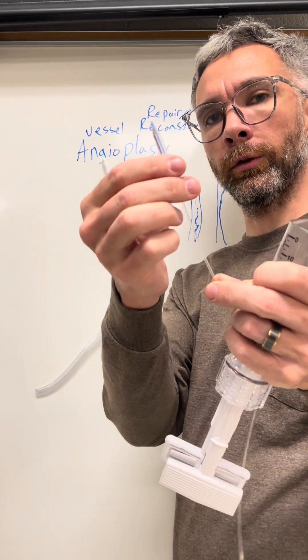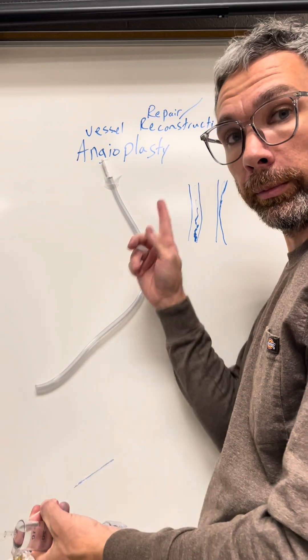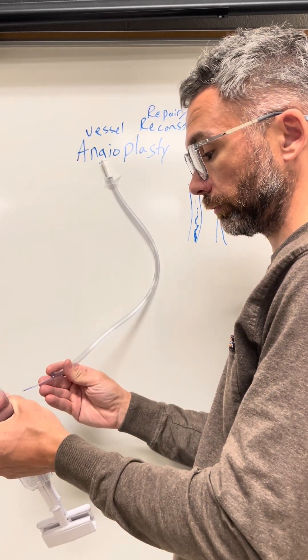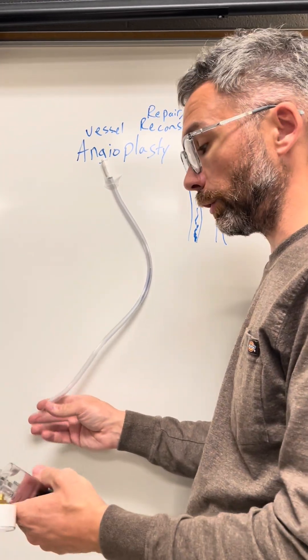As you can see, it blows a little balloon up right here. So what you're going to do is take this balloon, you're going to feed a wire up into your vessel, follow it with this into the area of concern that you're wanting to repair.